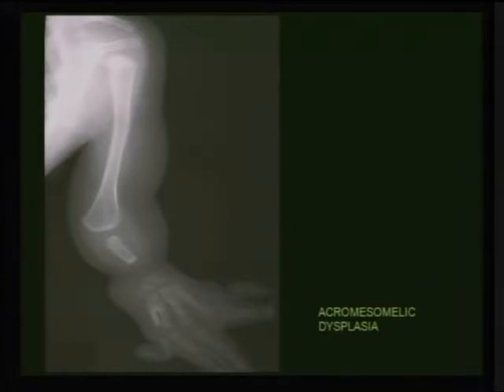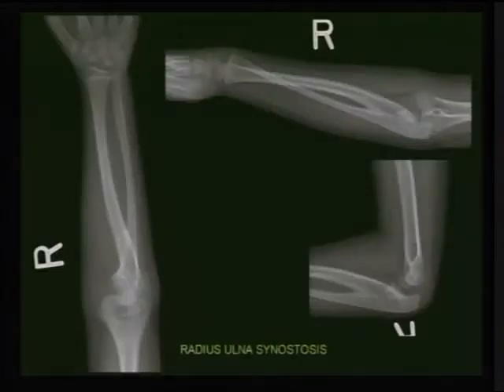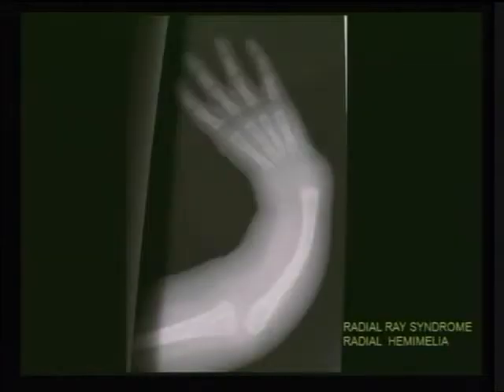This doesn't mean that we have reached a diagnosis, but at least we are speaking the same language as others, and we can look for these things on the internet. We can have the differential for that one. If the radius and ulna are abnormal, short, broad, then this is mesomelia. And you can tell the physician, I have a mesomelic kind of dysplasia, and you can link it to the clinical application. Fusion between the radius and ulna is radioulnar synostosis.